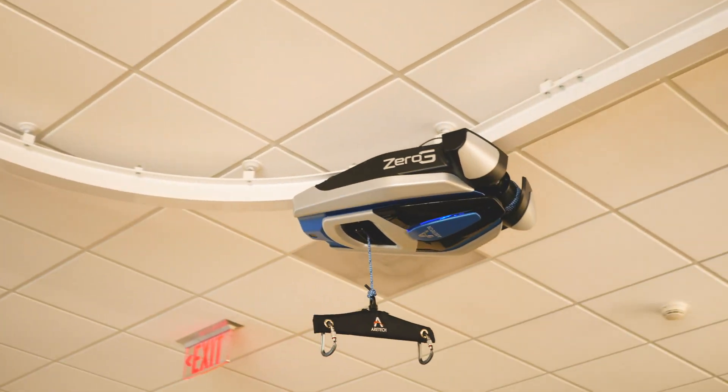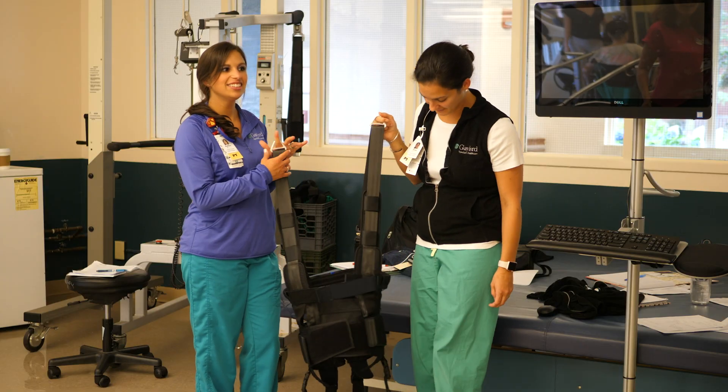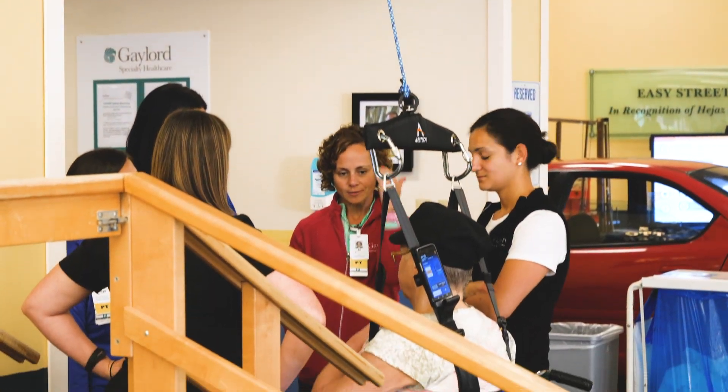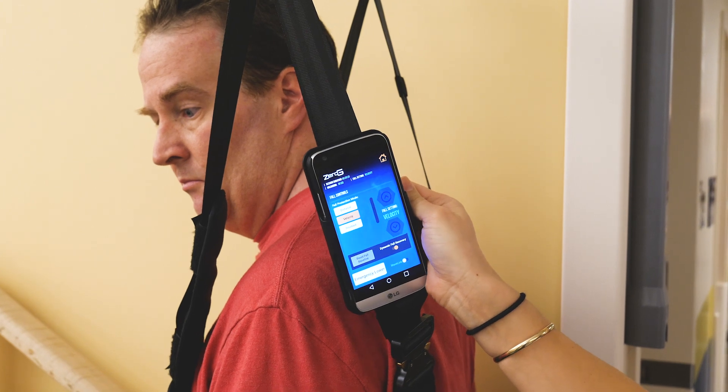There is a tracking system that goes along our ceiling, and then there's a spreader bar and a harness that attaches to the patient, and that attaches to the trolley system. The system works off of a computer and a remote control that the therapist can hold on to while the patient is walking.